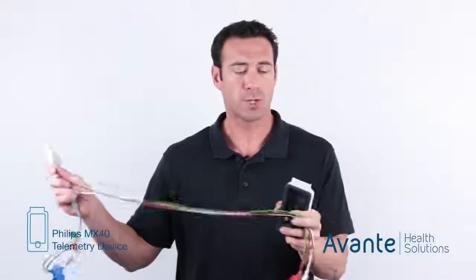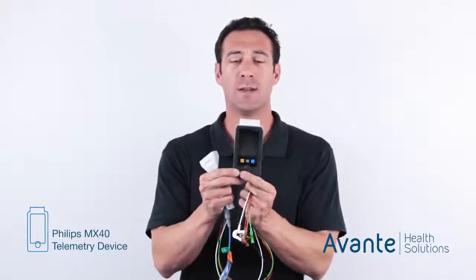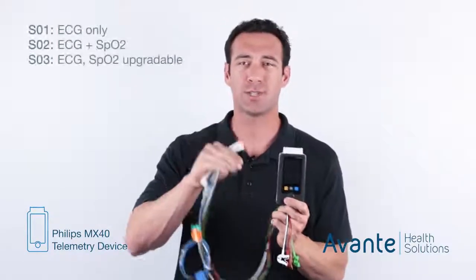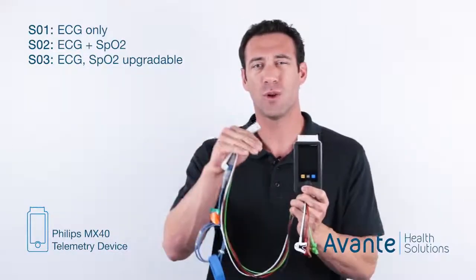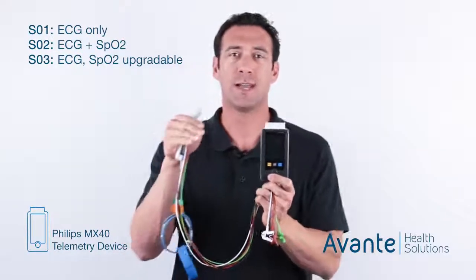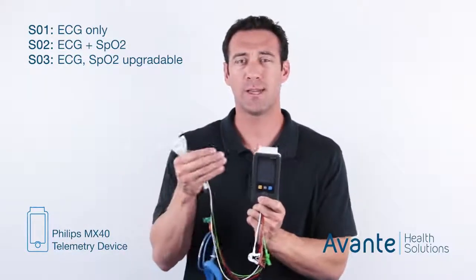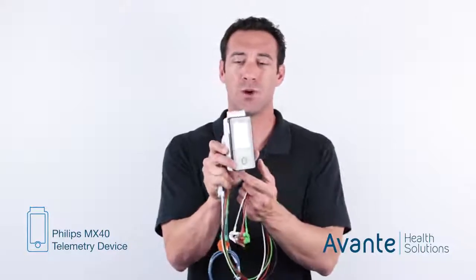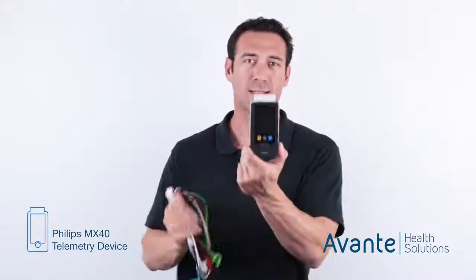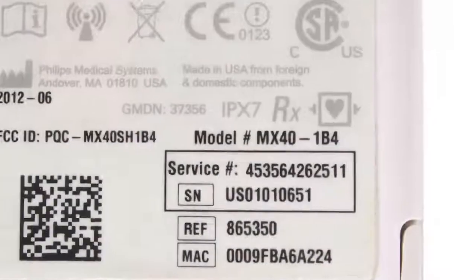They are also, much like the M4841 and the 2601A, 2601B, you also have the progression of an S01, S02, S03 case, where you'll go S01 ECG, S02 ECG and SpO2, and then the S03, which will be SpO2 upgradable. However, the case does not change at all, so they all will look precisely the same. How you can know, however, is that there's a number on the back.